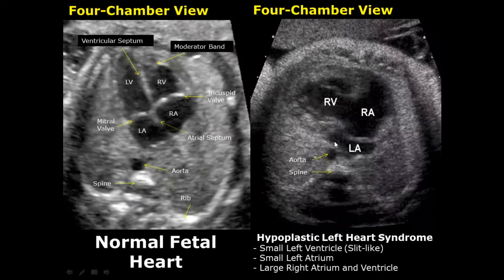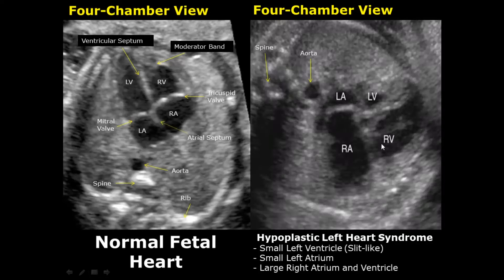In hypoplastic left heart syndrome, the left side of the heart will be smaller — we will have a small left atrium and small left ventricle — while the right atrium and ventricles will be enlarged. Here is another image of hypoplastic left heart syndrome showing small left atrium and ventricle and large right atrium and right ventricle.